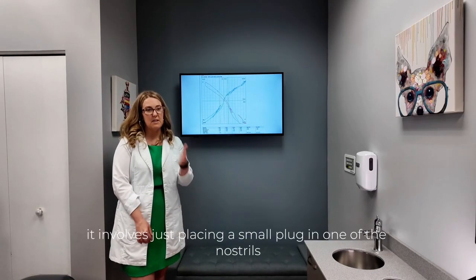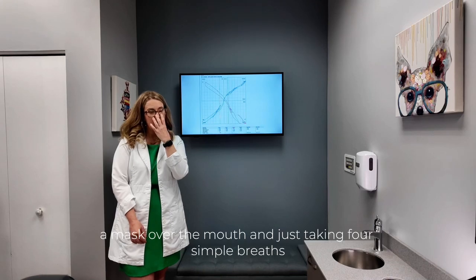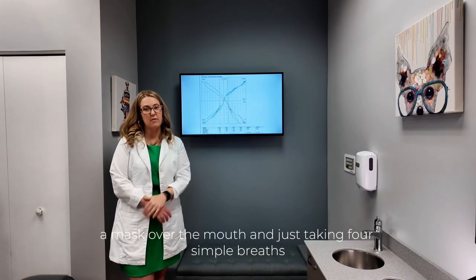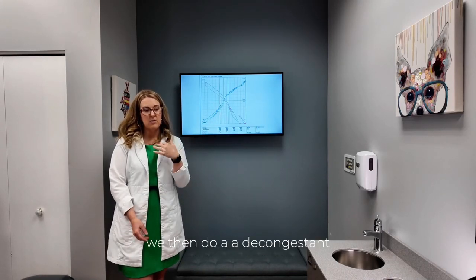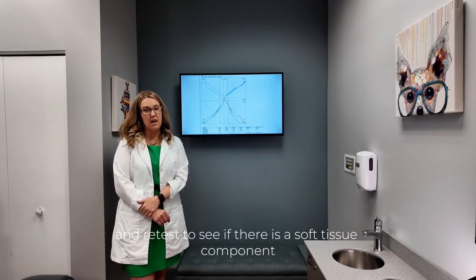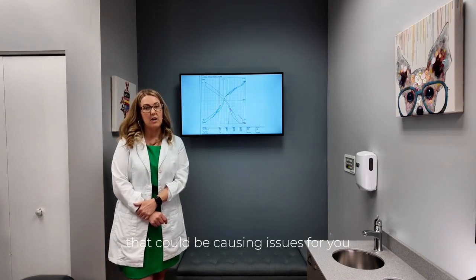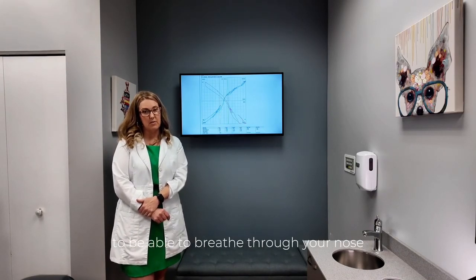It involves just placing a small plug in one of the nostrils and placing a mask over the mouth and just taking 4 simple breaths. We then do a decongestant and retest to see if there is a soft tissue component or an inflammatory component that could be causing issues for you to be able to breathe through your nose.